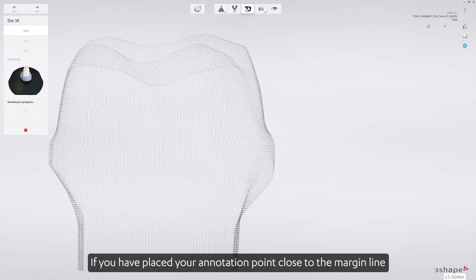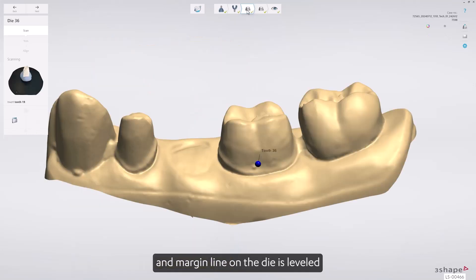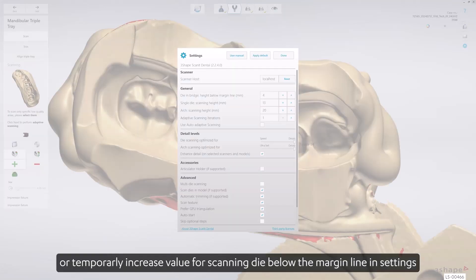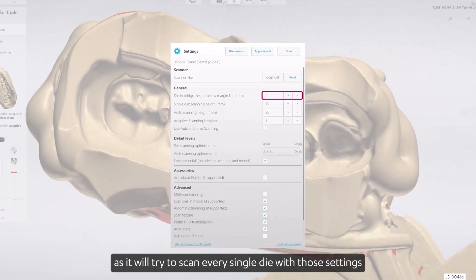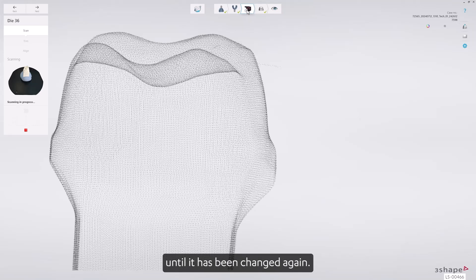If you have placed your annotation point close to the margin line and the margin line on the die is leveled, you will not need to worry about the scanner not capturing enough data. You can go back and fix annotation point locations, or temporarily increase the value of scanning die below the margin line in settings. But remember to bring it back afterwards, as it will try to scan every single die with those settings until it has been changed again.